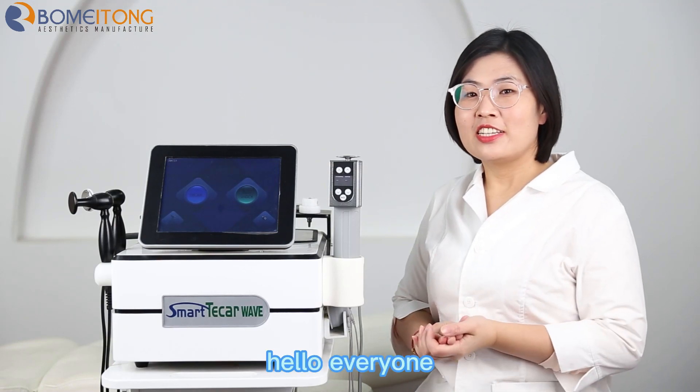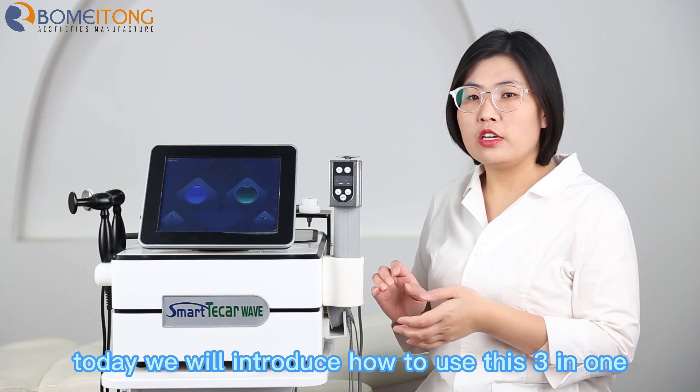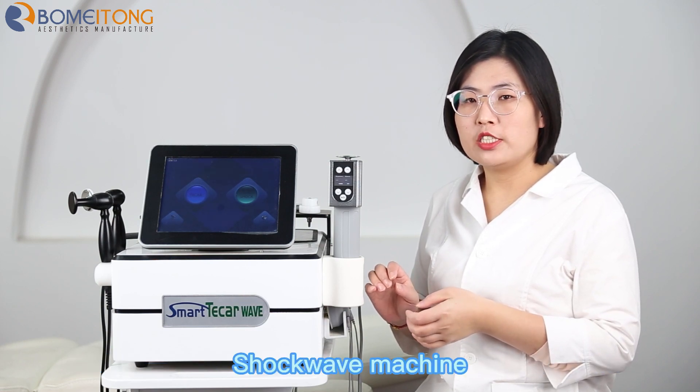Hello everyone. Today we will introduce how to use this three-in-one shockwave machine.